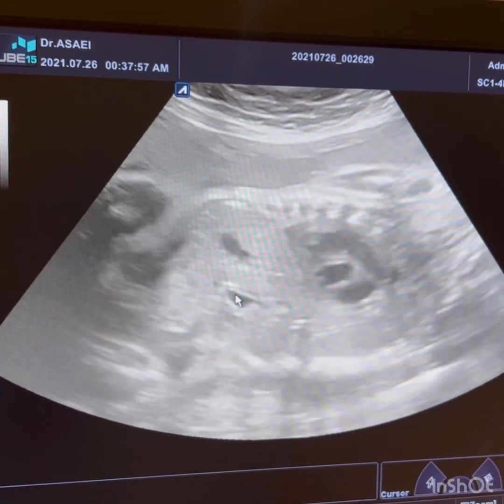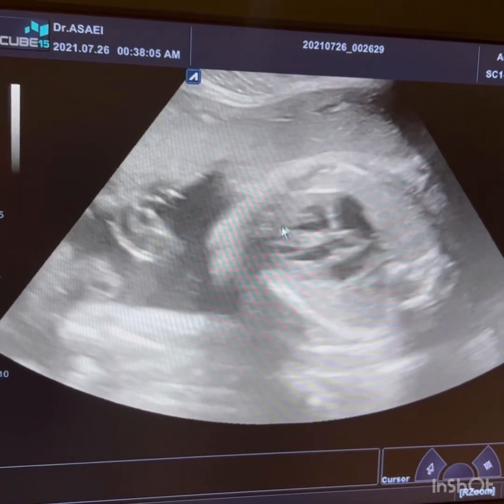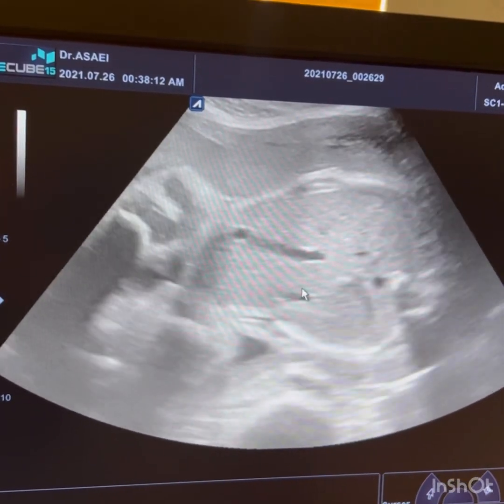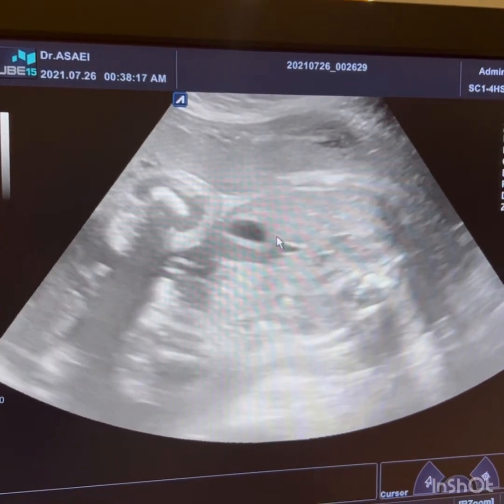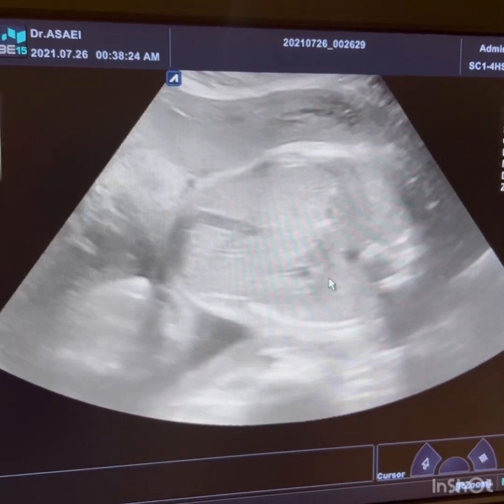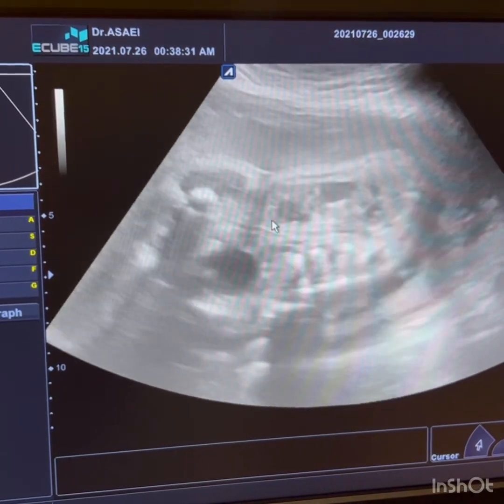In this fetus, the stomach is not well distended and it's contracted, but according to its normal anatomical place on the left side of the fetus, we can recognize it. Here we see the contracted stomach on the left side, but the gallbladder on the right side. There is also a hyperechoic rim around the contracted fetal stomach.